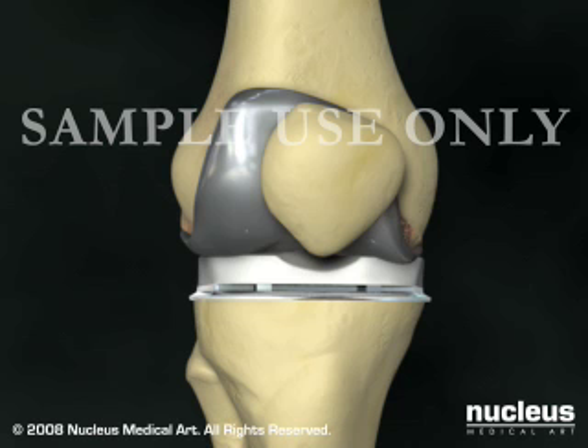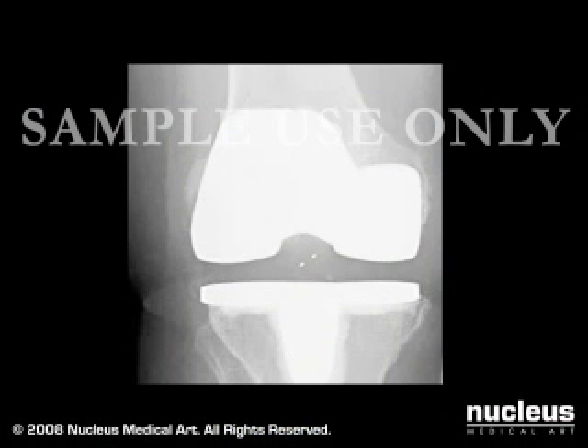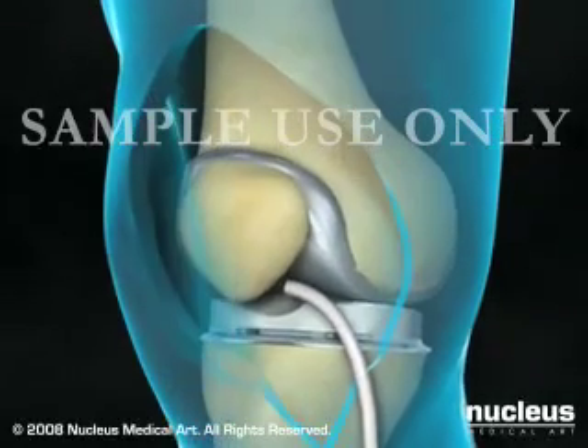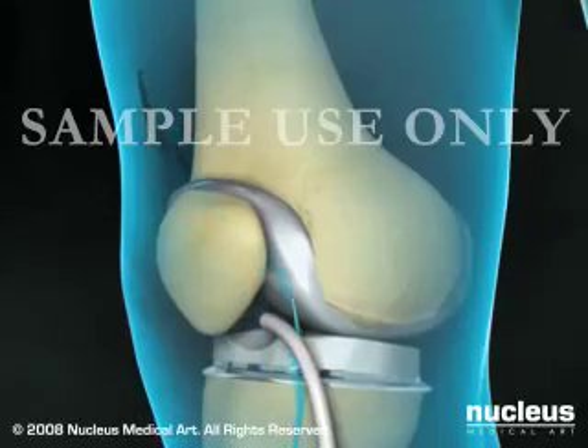Before your incision is closed, an x-ray will be taken to ensure that the new components of your knee are positioned correctly. Your surgeon will close the incision with stitches or staples, and temporarily leave a drain in place to remove excess fluid.